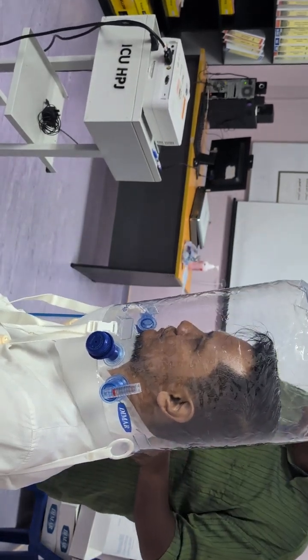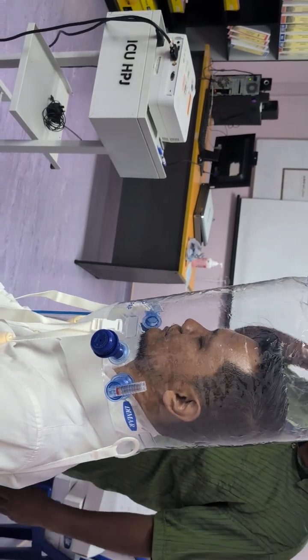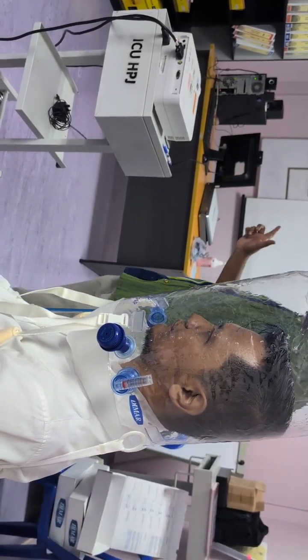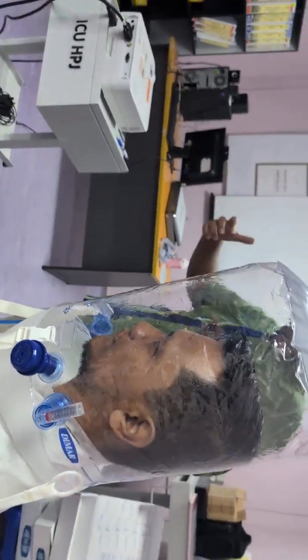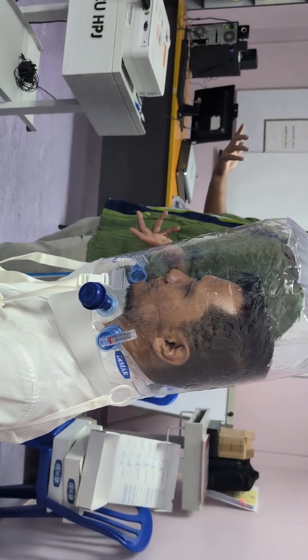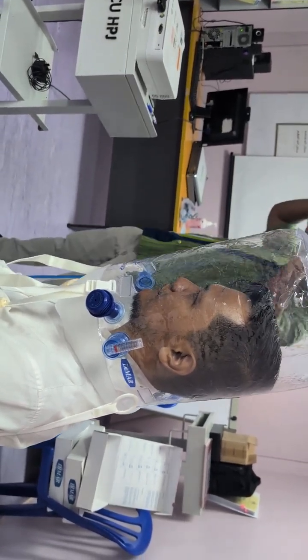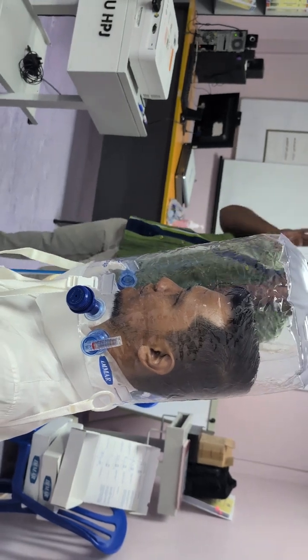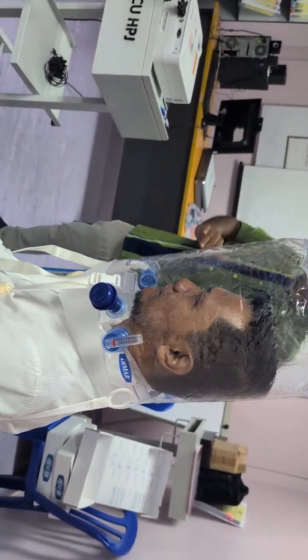If the patient is very cooperative to you, this sound may be something which is not nice to him. But after a certain period of time, which I cannot define, the patient will get used to it. Like when we go on an aeroplane, you know the difference of pressure and all that, our ears feel blocked, then later they stabilize. So that is what will happen.